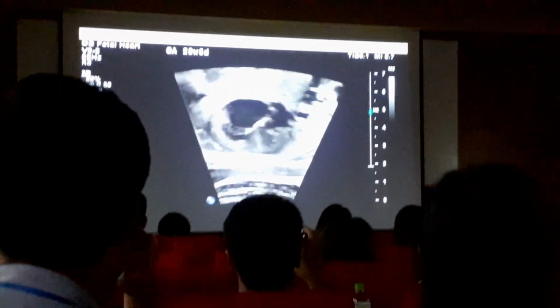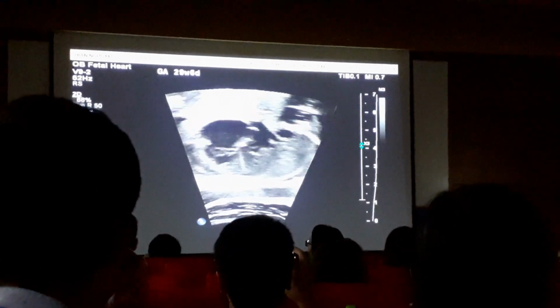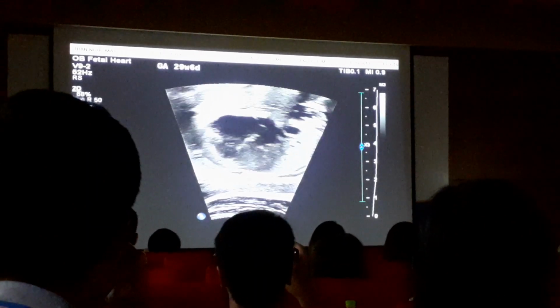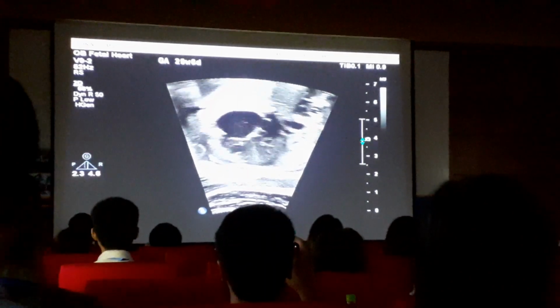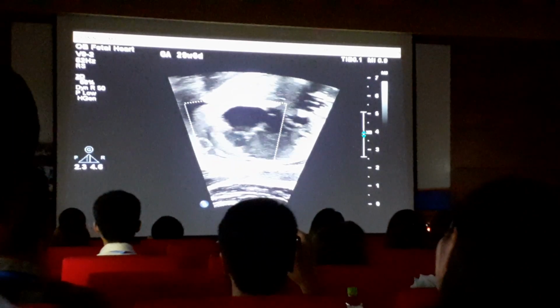The right ventricle is really starting to look quite hypertrophied. Cái thất phải mình thấy rất là rõ ràng là nó có phì đại hơn so với thất trái. Let's try to focus on that a little bit more. Mình tập trung vô cái thất phải trước.